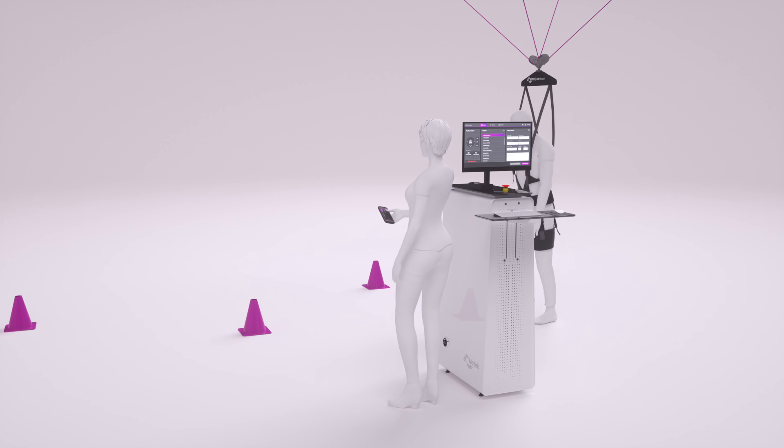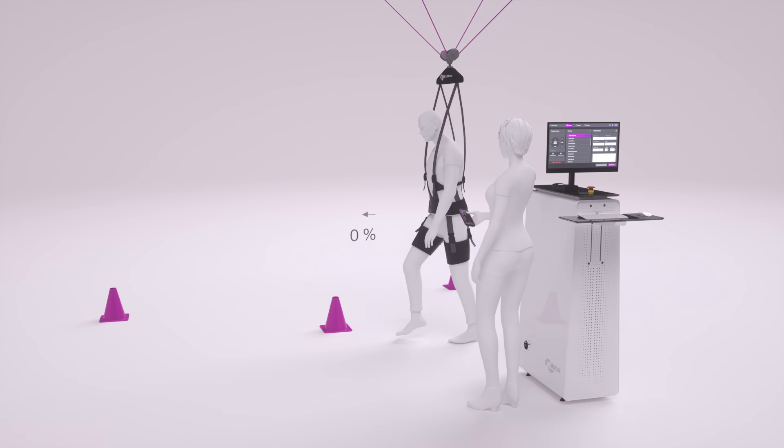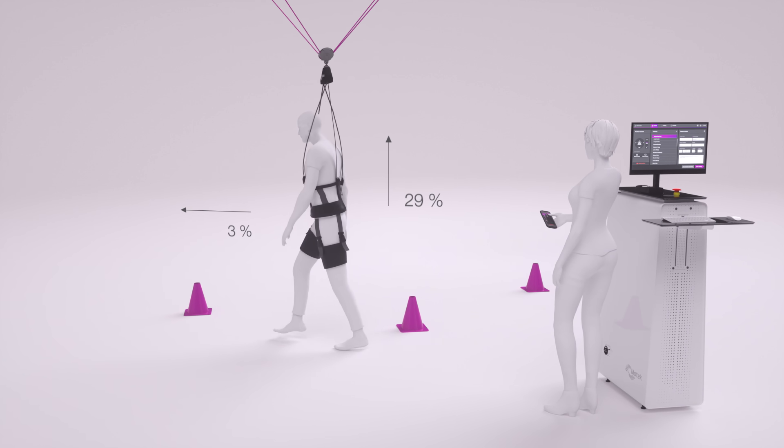Furthermore, the therapist can continually adjust these forces to the patient's current level of movement proficiency.